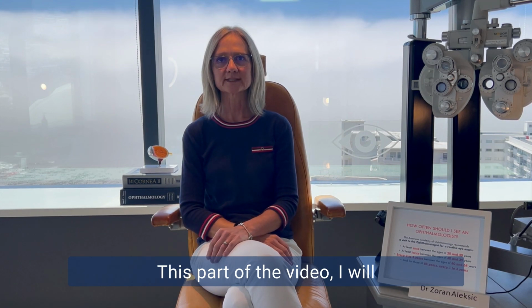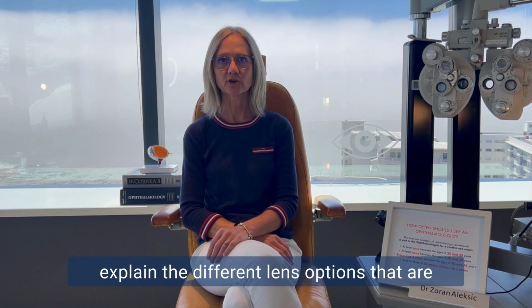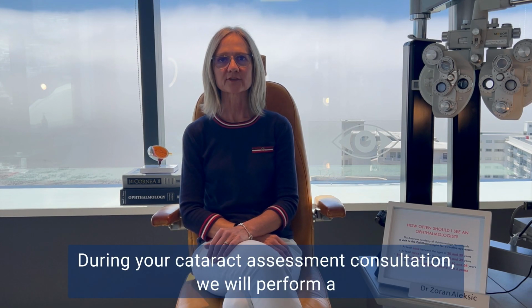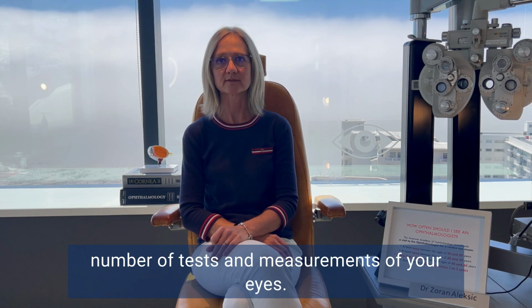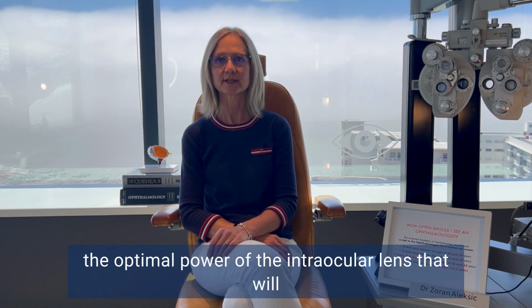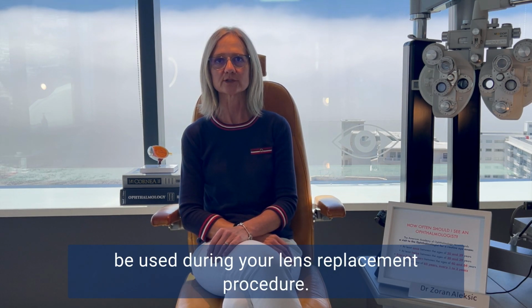Of the video, I will explain the different lens options that are available to you during your cataract surgery. During your cataract assessment consultation, we will perform a number of tests and measurements of your eyes. This information is used in specialized formulas to calculate the optimal power of the intraocular lens that will be used during your lens replacement procedure.